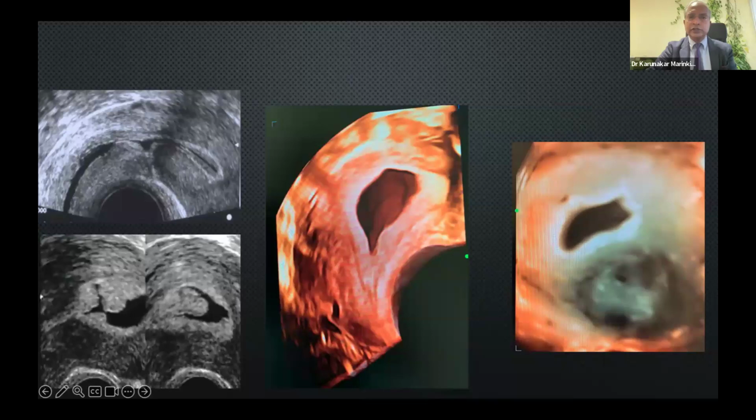In this slide, I'm just showing one thing. As you can see, there is cervical mucus, and this mucus sometimes gets sucked into the endometrial cavity. So I have a 17-case audit on endometrial cavity fluid and how it affects ART.